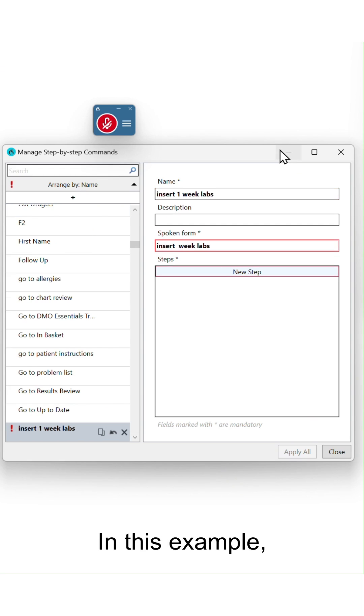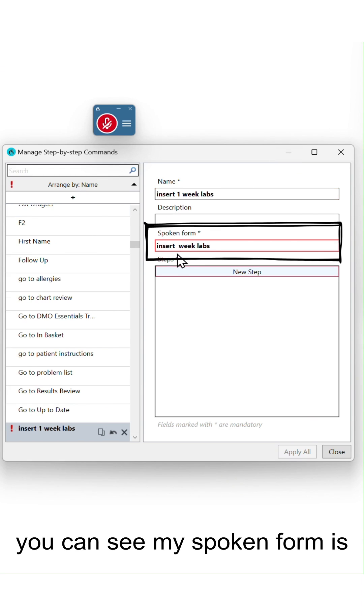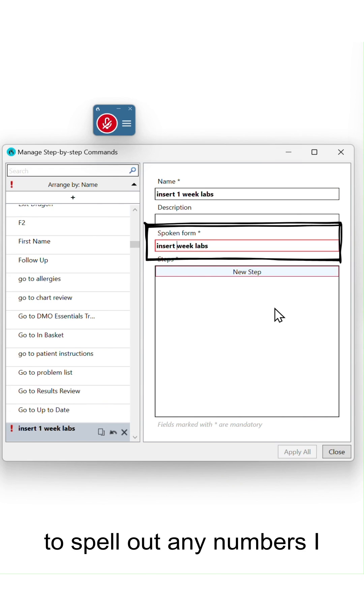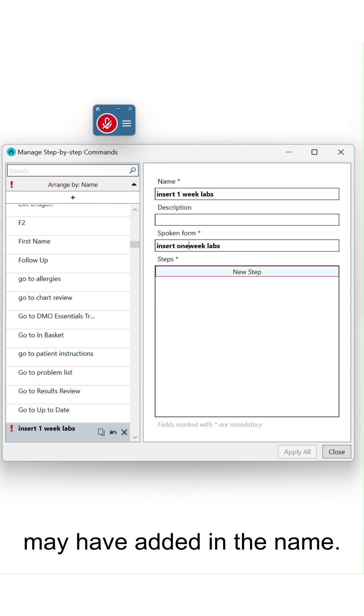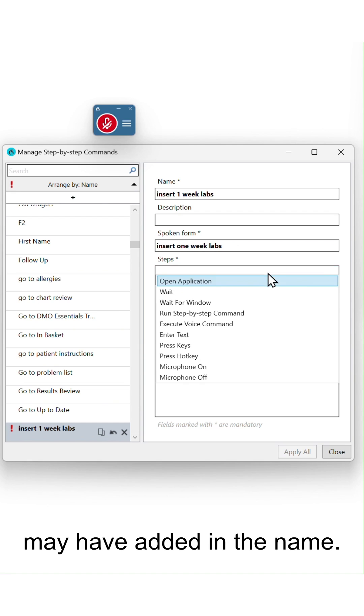In this example, you can see my spoken form is highlighted in red because I need to spell out any numbers I may have added in the name.